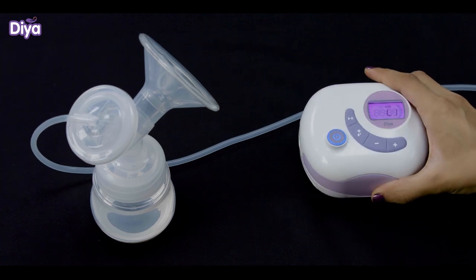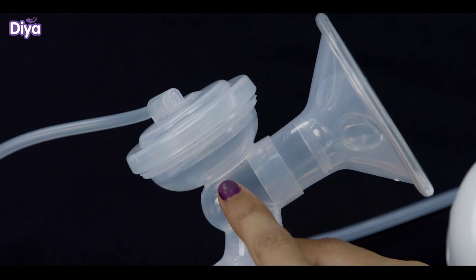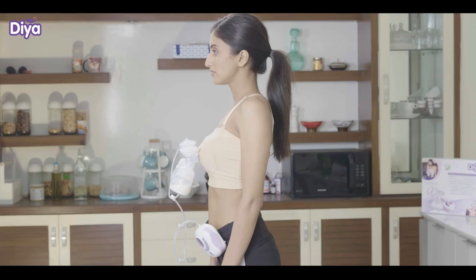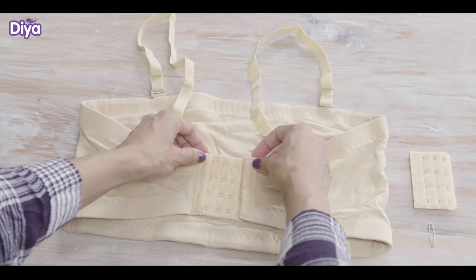When the motor is switched on, the silicon diaphragm should start moving up and down. If not, please ensure that you have assembled correctly. Now wear the pumping bra and adjust it according to your size.